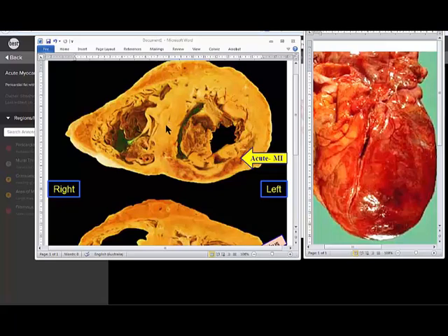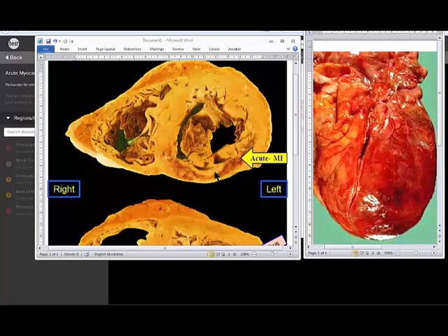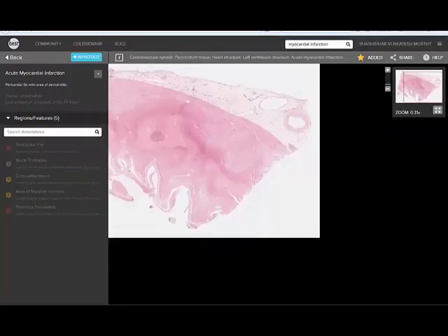The intraventricular septum, the left ventricle, right ventricle. There are big thrombus attached to the area of the infarction, area of the infarction because there is dead tissue. Mural thrombosis, remember that is a complication. This extensive area of infarction, how it would look like in the microscopic. We will go through the microscopy.